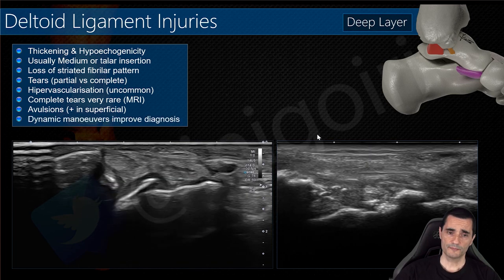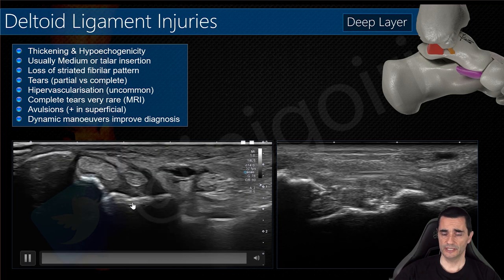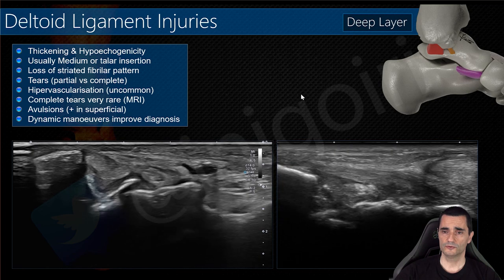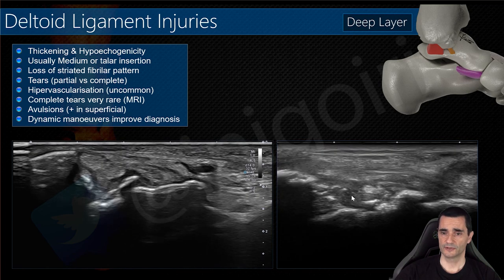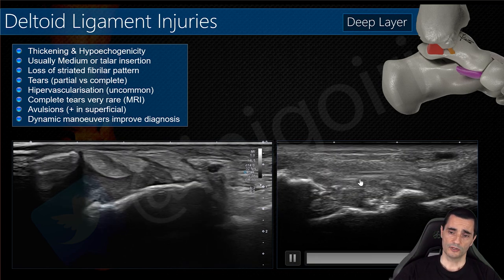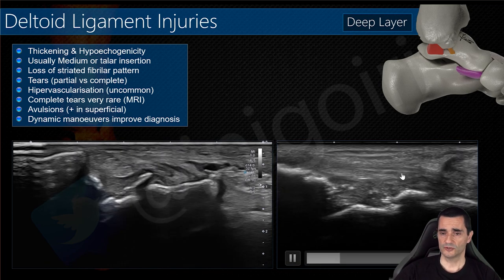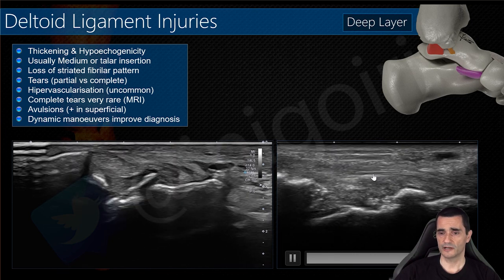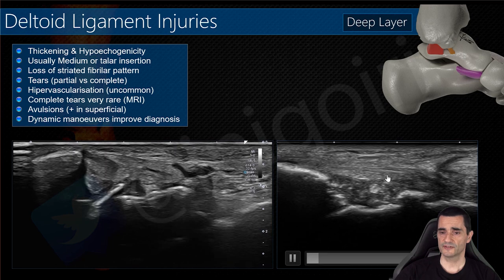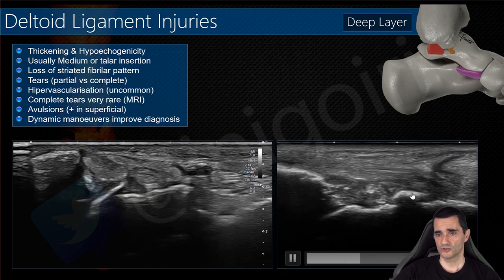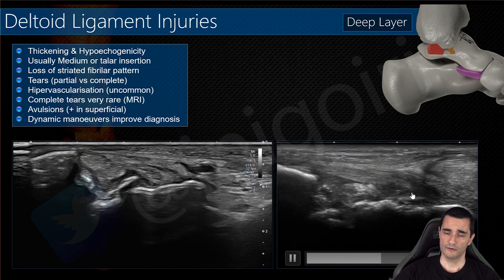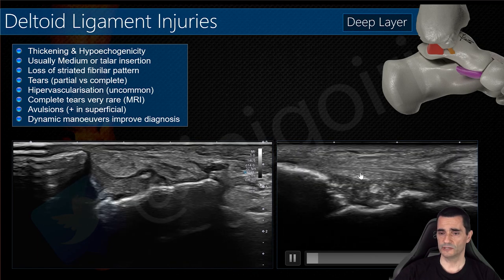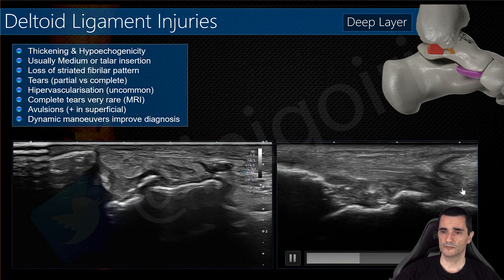Always perform dynamic maneuvers. For the posterior tibiotalar ligament, dorsiflexion is mandatory to obtain a good view. You can also perform plantar flexion to assess the anterior components — the tibionavicular and the tibiospring ligaments. Valgus maneuvers can help us distinguish the tibiocalcaneal components.